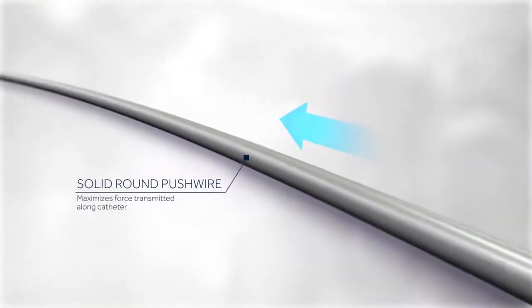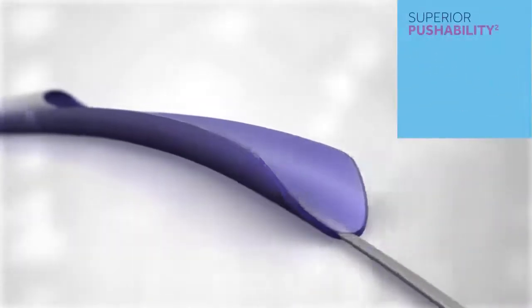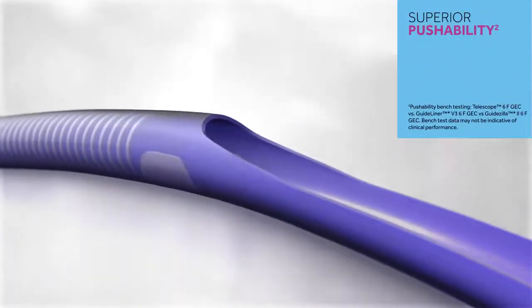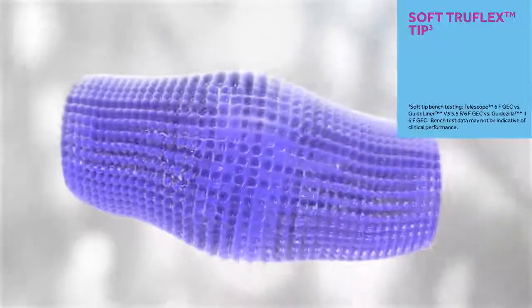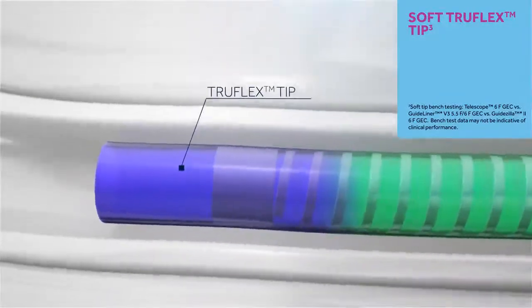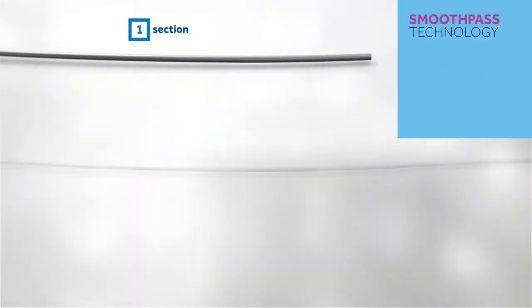A solid round push wire maximizes force transmitted along the catheter for superior pushability. Our soft TrueFlex tip is made of a soft polymer melted in shape to precise dimensions, responsively deflecting and providing flexibility.